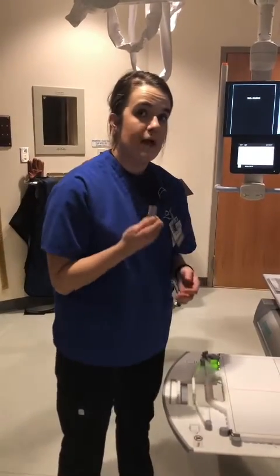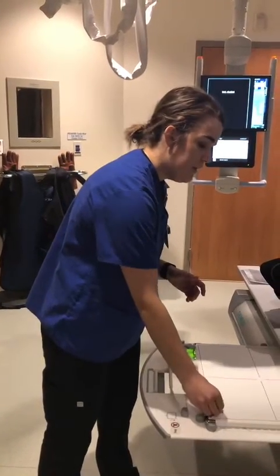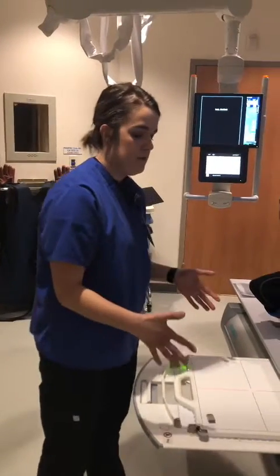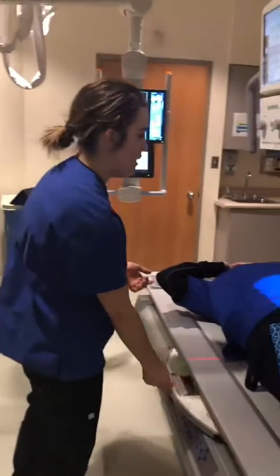I'm going to stick a right marker on the right side of this image receptor. Stick it in the corner here, making sure that it's not in any anatomy of interest. Since this is a 14x17 image receptor, sticking it here should be fine. I'm going to stick this back in here.